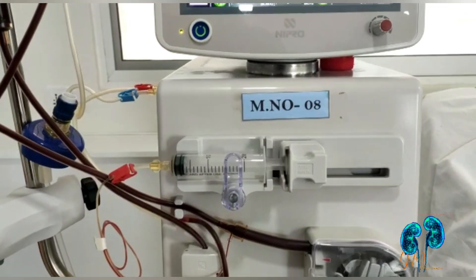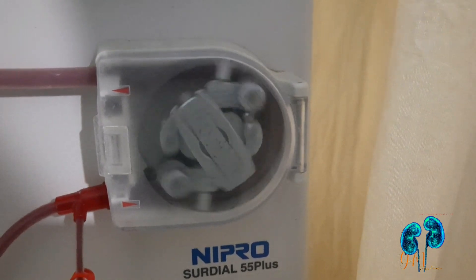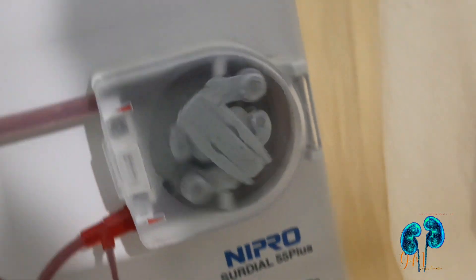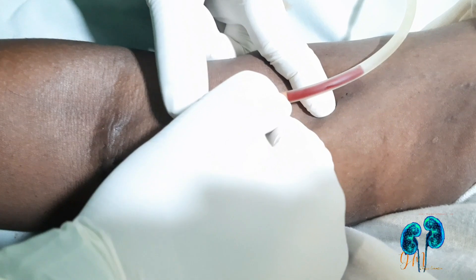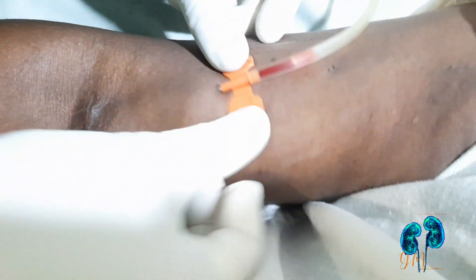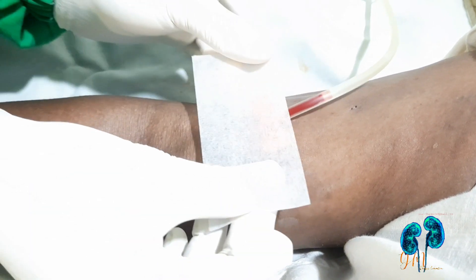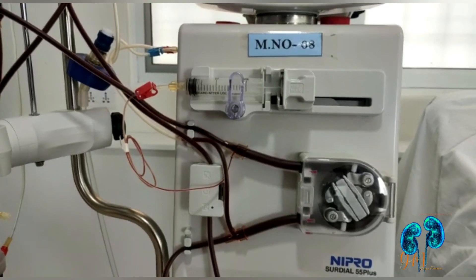Today we are going to discuss the fistula occlusion test for checking maximum blood flow for AVF and AVG, and also how to determine the minimum blood flow which should be maintained for the fistula occlusion test.